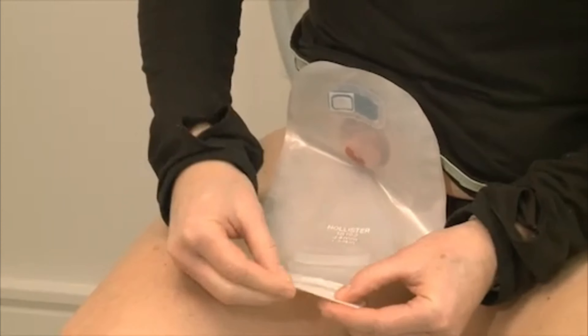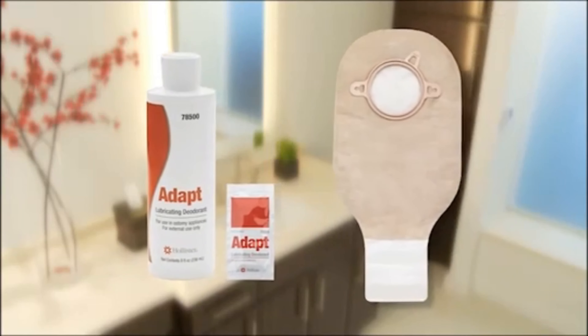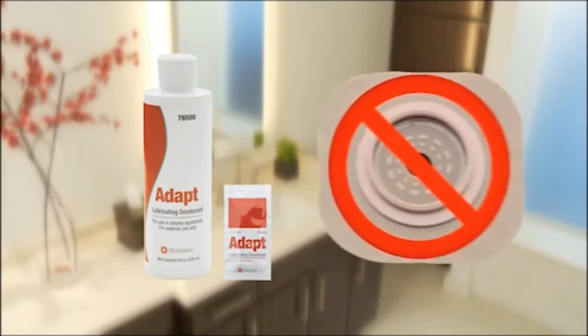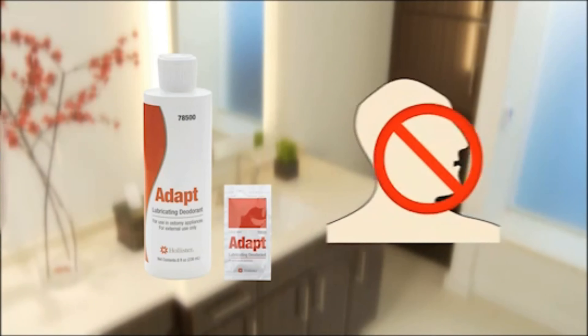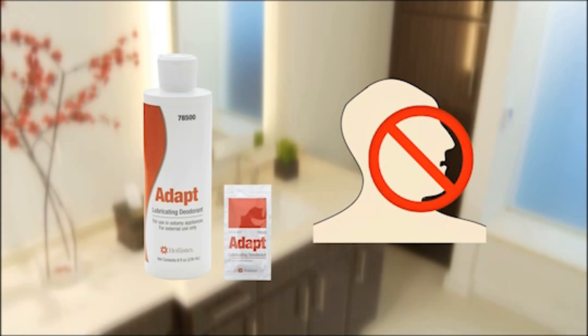With Adapt Lubricating Deodorant, rinsing is not necessary after emptying. Adapt Lubricating Deodorant should not be applied to a skin barrier, nor should it ever be taken internally.